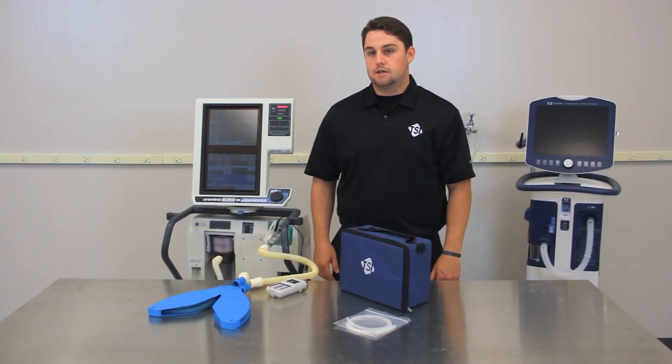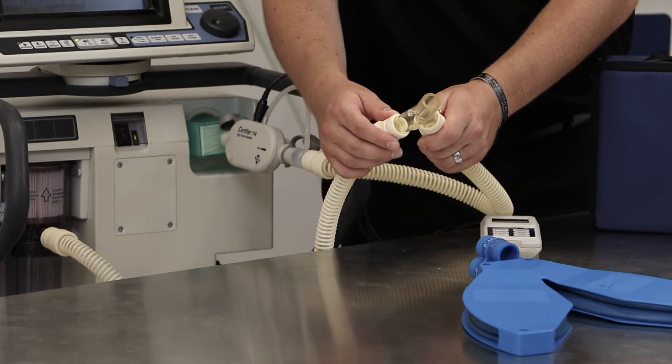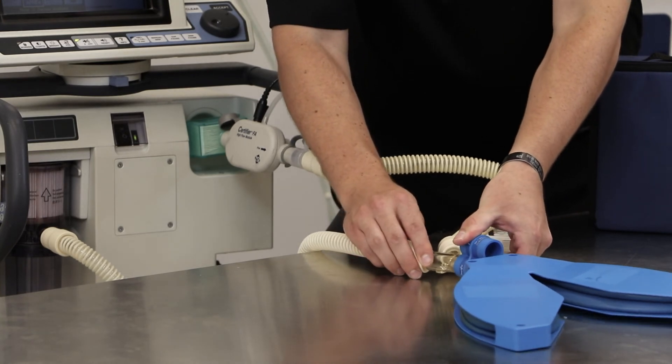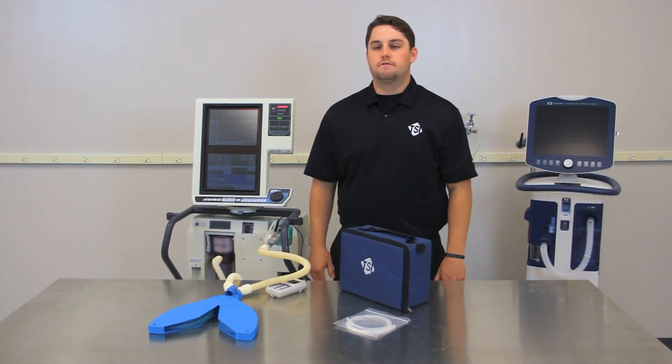After that has been done, connect your Y fitting to the ends of the inspiratory and expiratory tubing, and then finally connect the Y fitting to the test lung. It is always a good idea to verify that you have everything set up correctly as displayed here before proceeding.